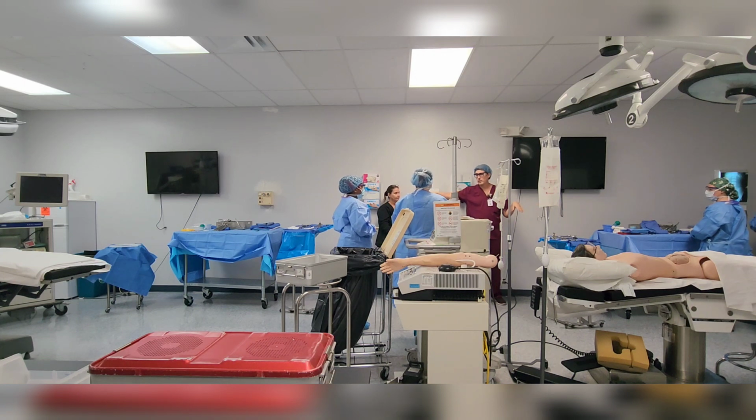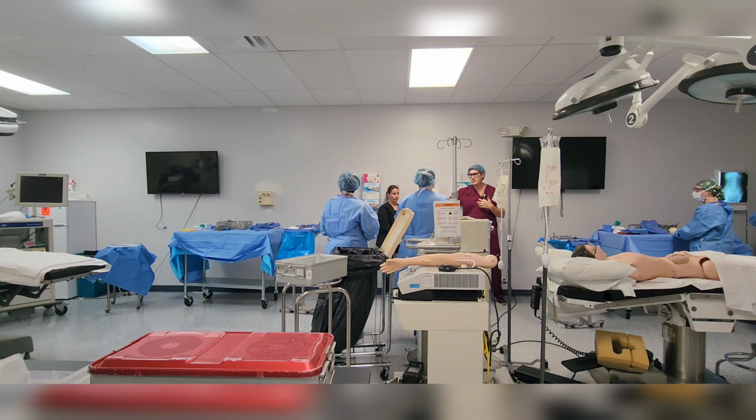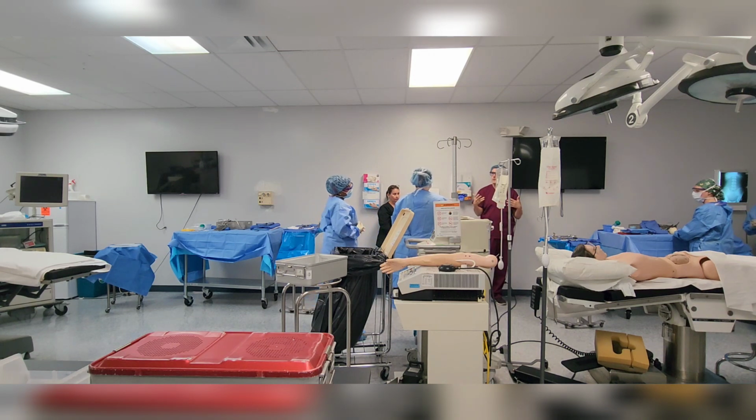Can you get to the field? Can you gather yourself? Can you do a count? Do you know basic instruments? Can you help drape? Can you pass properly? It's not like something we have not shown you. Everything else will come with time, as we show you more extensive things.